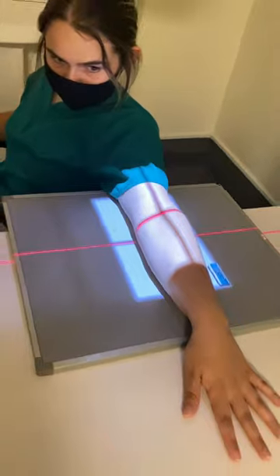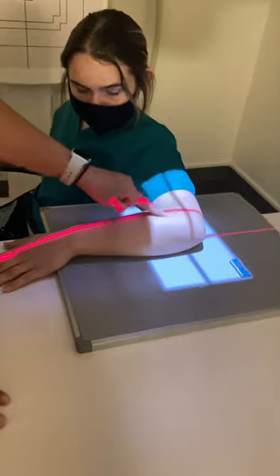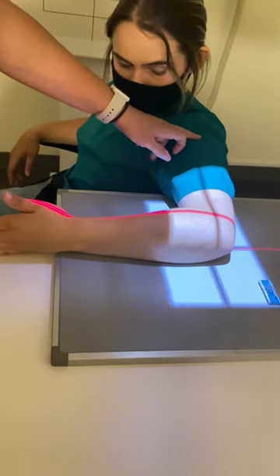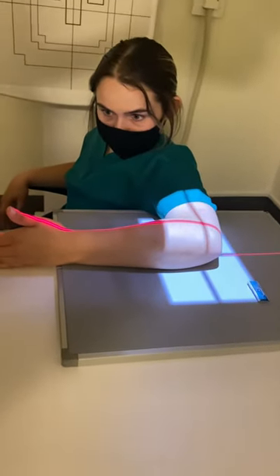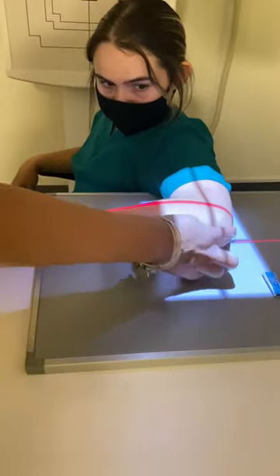For the last one, we're going to do the lateral. I'm going to have you bend your elbow. We need to make sure that we're at a 90-degree bend in the elbow. The wrist needs to be lateral as well, and we need to ensure that the shoulder and the elbow are on the same plane for a true lateral. I'm going to raise the table up just a little bit, and we want to center one inch in from the olecranon process.